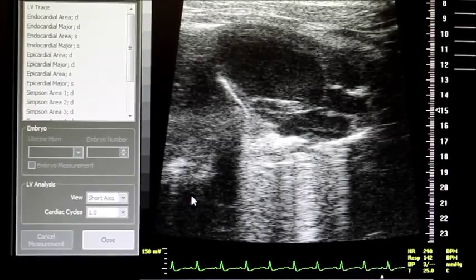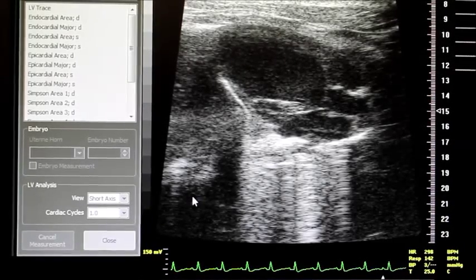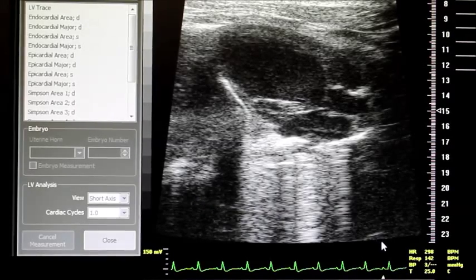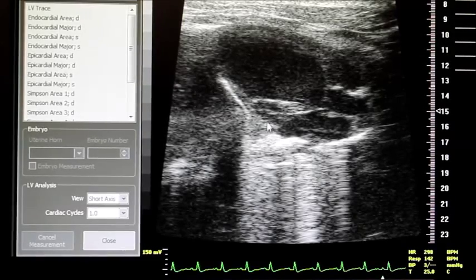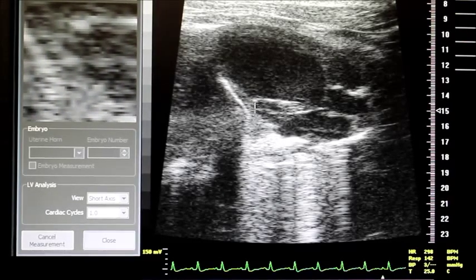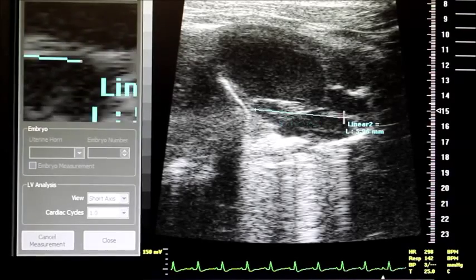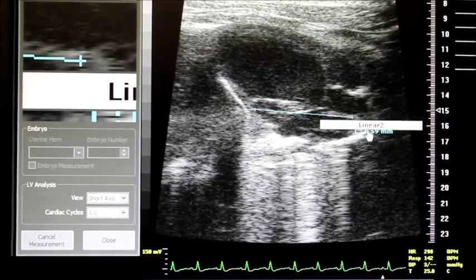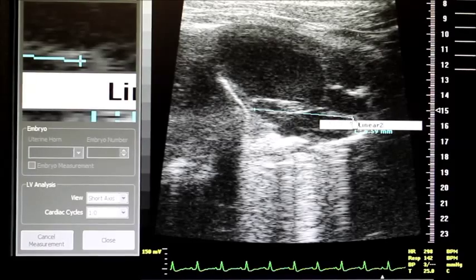The superior inferior dimension will be measured using the recording of the left atrium in the long axis view. First, the end diastolic left atrial phase should be found, as it's shown over here, which matches with the P wave. Then, the dimension should be measured from the vertex of the left atrium all the way towards its base. This should be done following the orientation of the left ventricle and the aorta, as shown here.